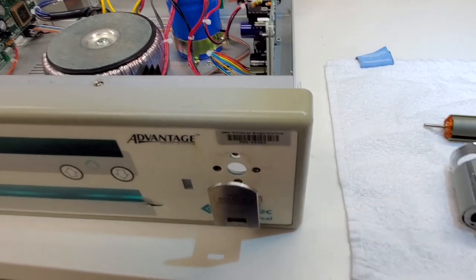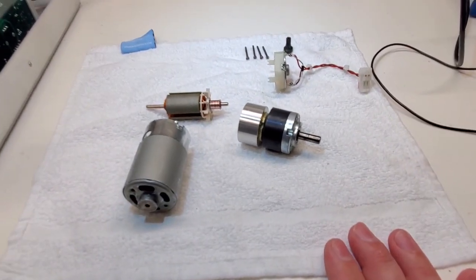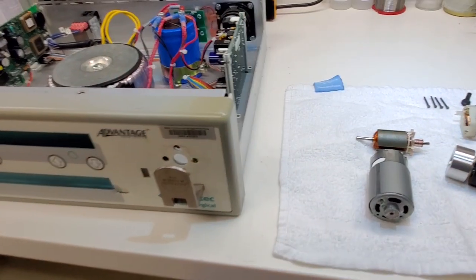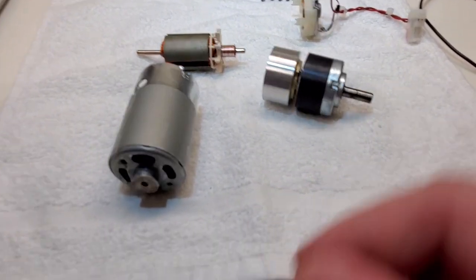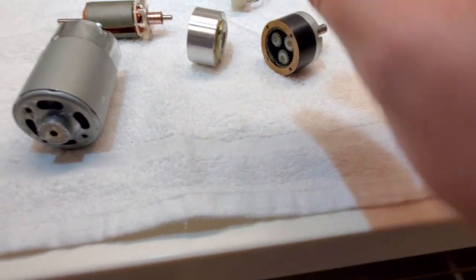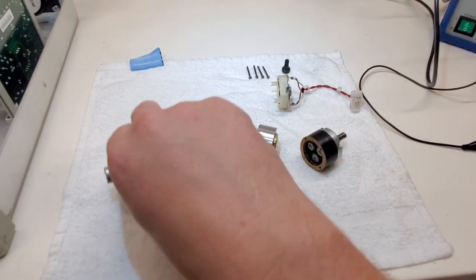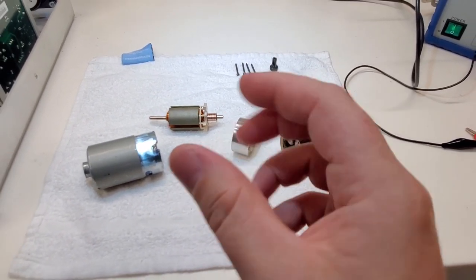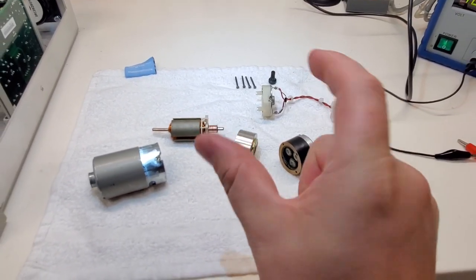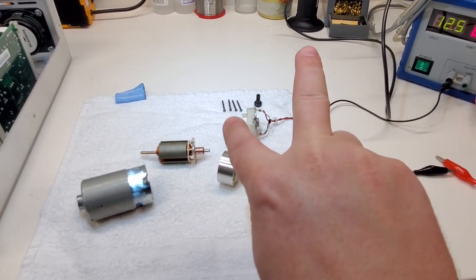You know, you got your standard retention screws in the faceplate. Doesn't really make sense. It's just another manufacturer just screwing over hospitals. But here we are, planetary gear set. That's gear reduction. As you guys hopefully know, when you revolve something, when it spins, RPM and torque are usually inverse of each other, kind of like voltage and current, amps.